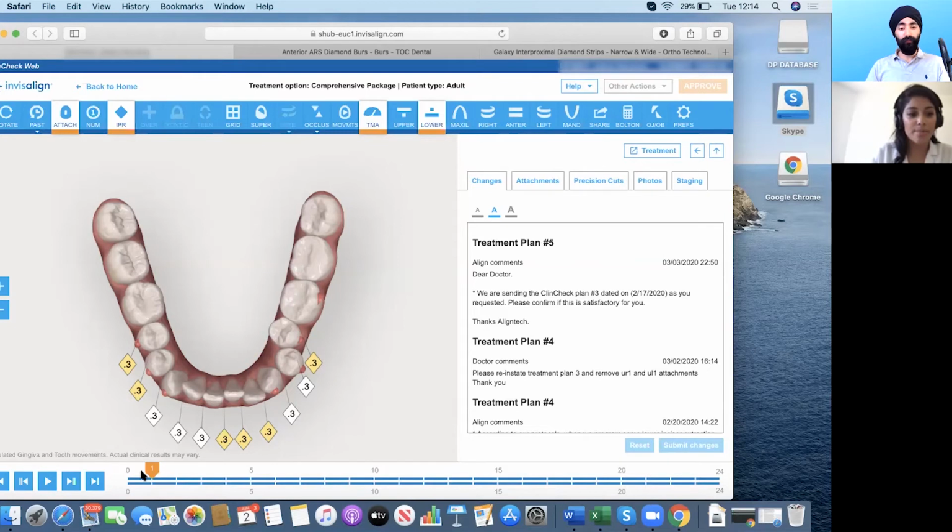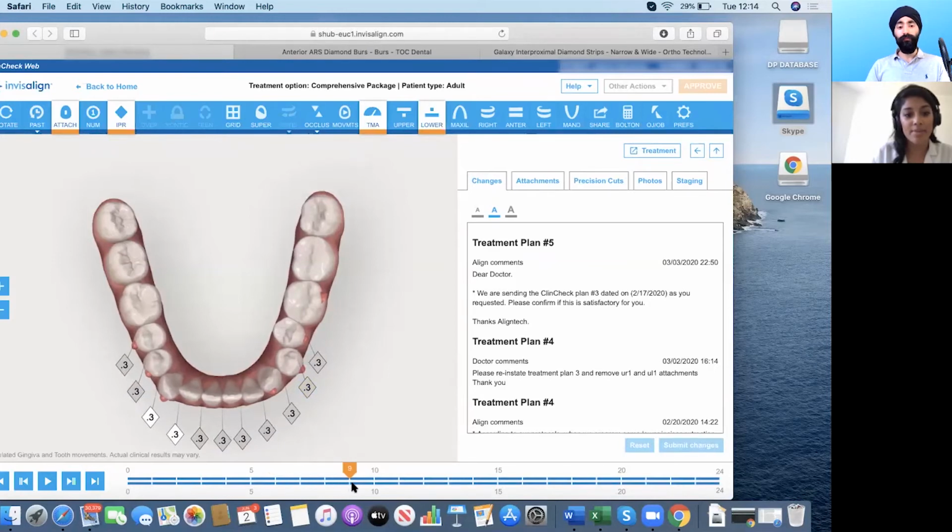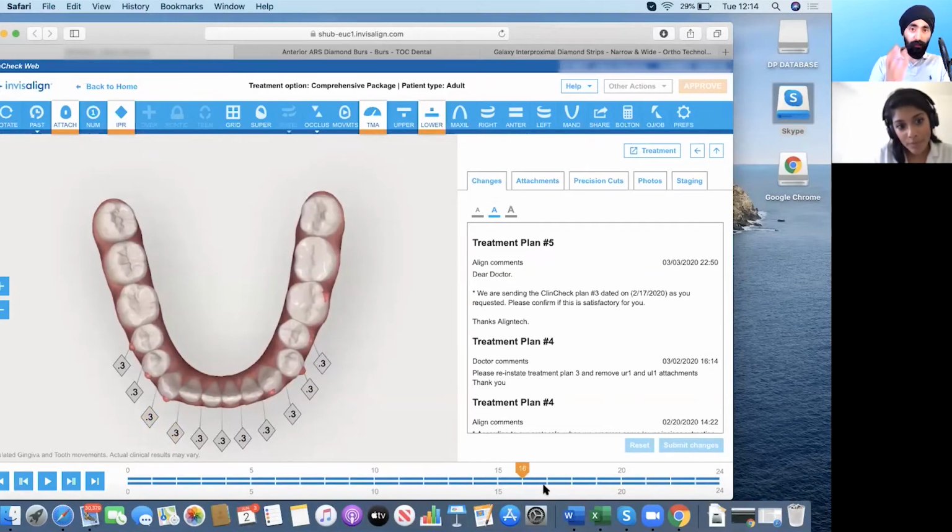So I use my gauge. I even up the contacts. The teeth will then start to move. And you can see that it's been planned so that as the teeth need it, the IPR is taking place when it's highlighted in yellow. And you're using the Devaki approach of sequential stripping as you go along?